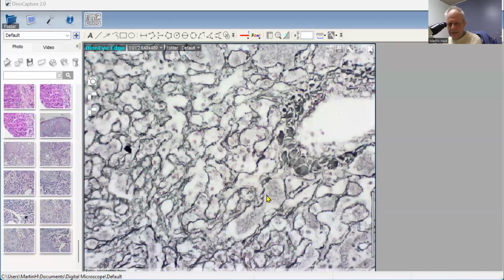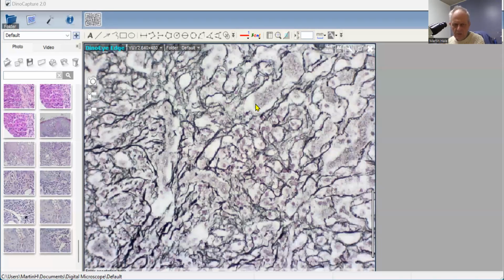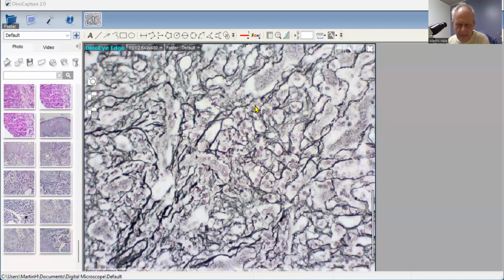But when we get to this area here, which is in zone 1 and zone 2, you've actually got a collapse of the reticulum because the hepatocytes have died. And it's very much like taking an ordinary common or garden sponge. When you squash it, you squeeze the air out. And when you release it, the air comes back in and the sponge returns to normal.